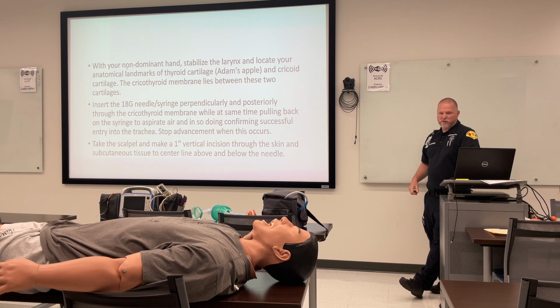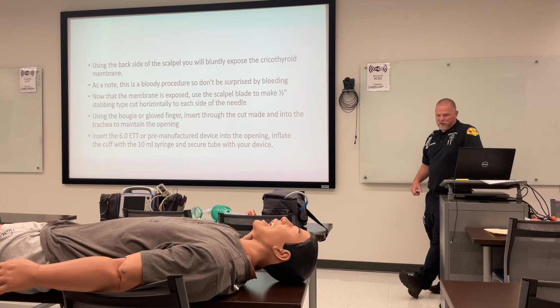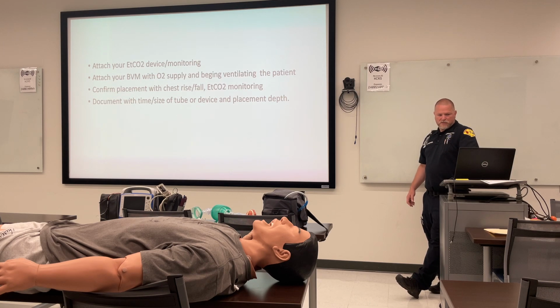At this point is when you would add your bag valve mask to it, and your end tidal device, which would help confirm. You're gonna look for the rise and fall of the chest when you squeeze the bag, and you're gonna look for your end tidal readings on your monitor. You're gonna document how far in you went. You're gonna document what tube you used, whether it was the Shiley. You're gonna document the placement and its depth if you're using an end tidal tube.